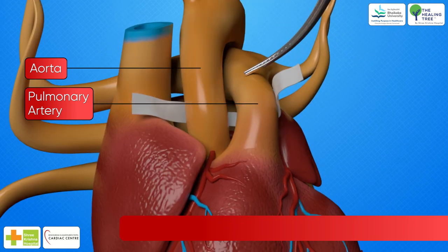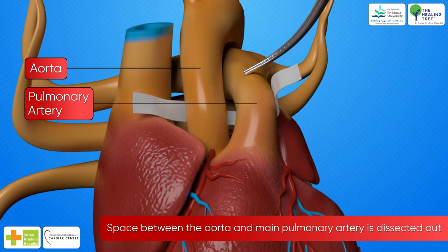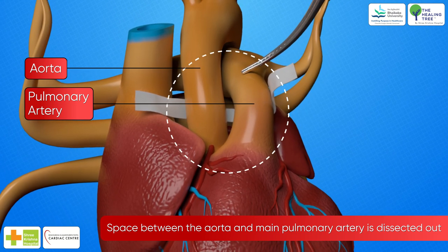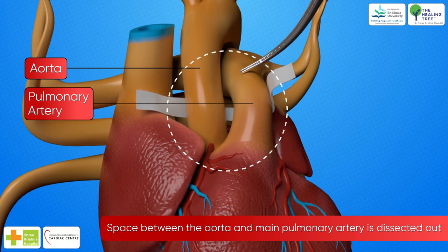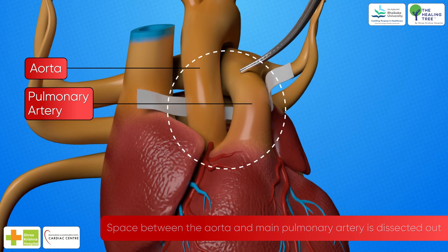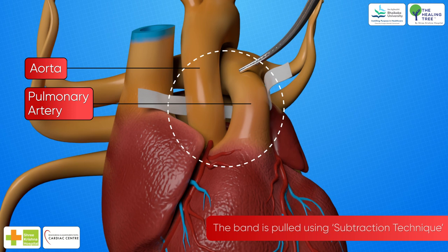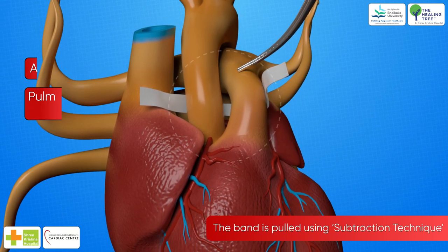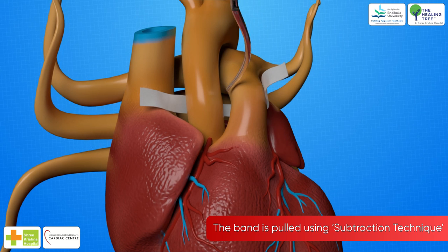Then the space between the aorta and the main pulmonary artery is dissected out. Care must be taken to avoid or to coagulate the small veins that run between the two vessels. Now, by subtraction technique, a right-angled clamp or dissector is passed around the aorta.